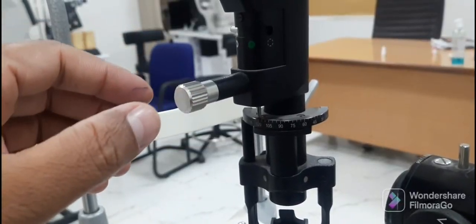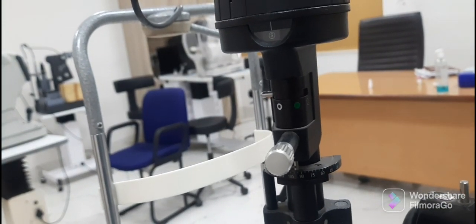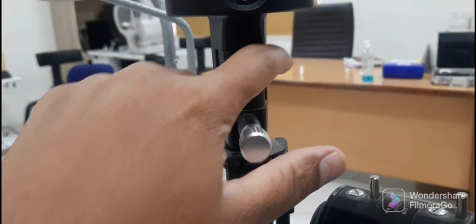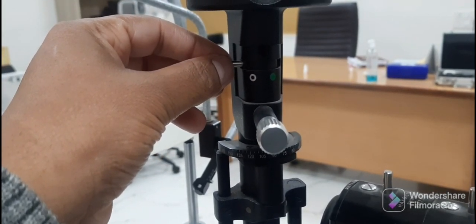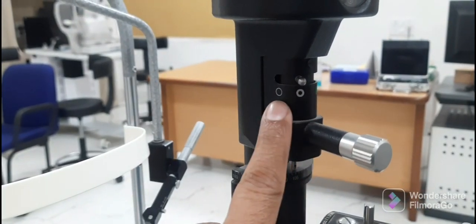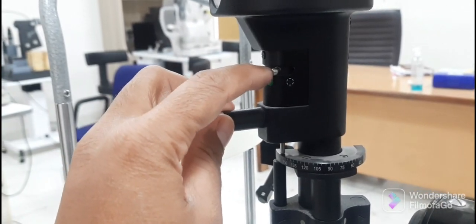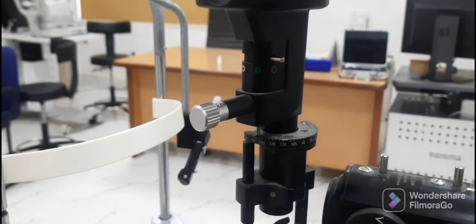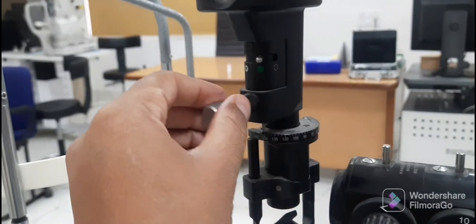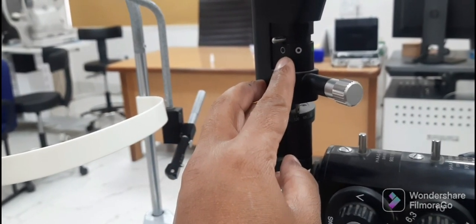This knob is used to adjust the height of the slit beam. Just above this knob, there is one more lever used to change the filters of the slit lamp. There are four positions, appearing circular. The first has normal light, the second is a neutral density filter, the third is a red-free filter, and the fourth has no filter, shown by dotted lines. You can change the filters by shifting the lever to the four marked positions on the illumination arm.